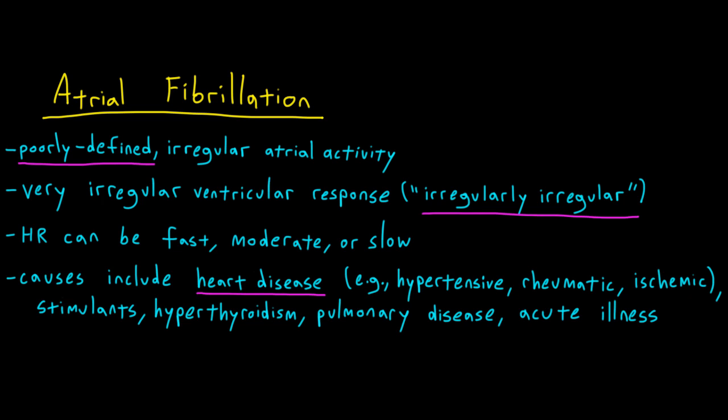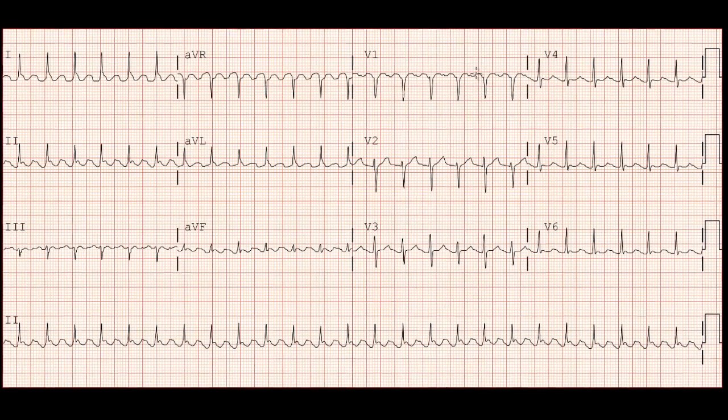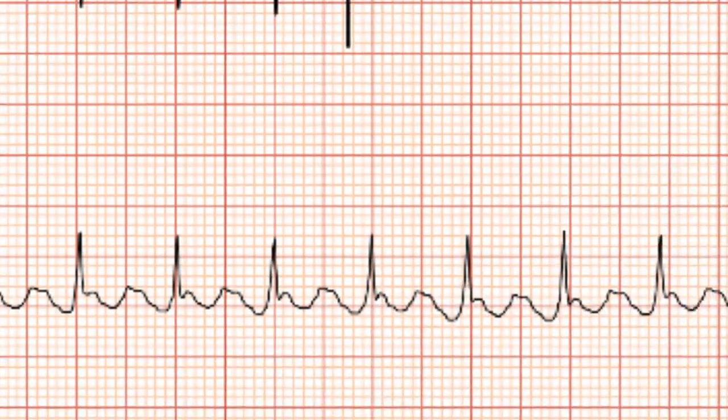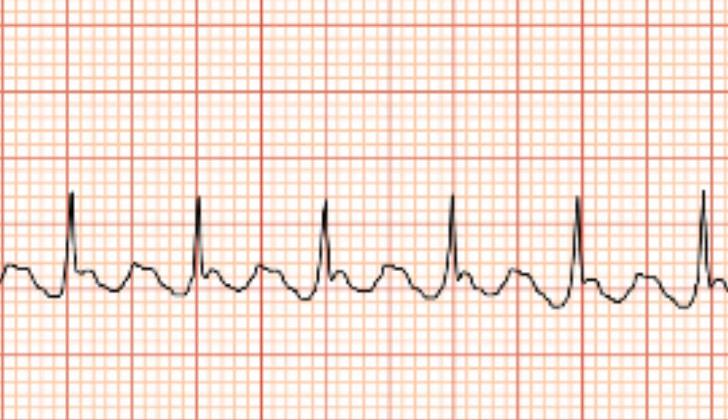Now let's go ahead and look at another EKG. I just want to know one thing. What's the rhythm? So here we can see it's pretty regular. We've got a consistent spacing between each consecutive QRS complex. But we don't really see good, normal-looking sinus p-waves.